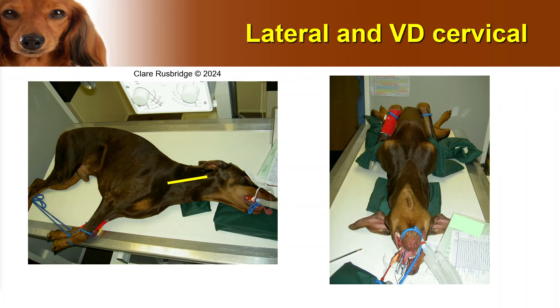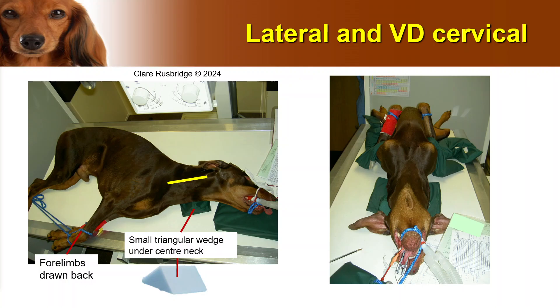Here's another example. It's quite common for Dobermans to get neck disease, and although in many instances we would choose to obtain CT or MRI these days, there may still be some call for taking preliminary radiographs in primary practice or when further diagnostic imaging is unavailable. You can see that the limbs have been pulled back because we definitely want to get to that C6-C7 region in this breed, as that is the most common one that is diseased. We want to make sure the neck is supported — that's the triangular wedge going under there — because this is a very floppy-neck breed, and we also need that triangular wedge going underneath the jaw.